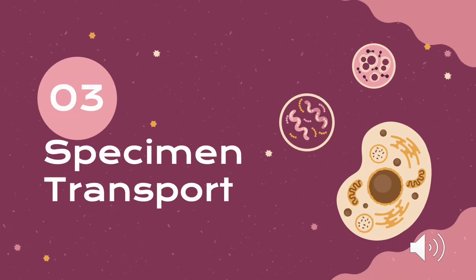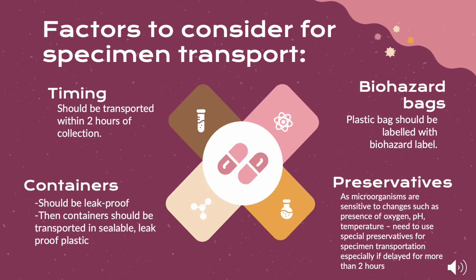In this section, the specimen transport concept will be discussed. These are the factors to consider for specimen transport. First is the timing. The specimen should be transported within 2 hours of collection. Next is the containers. Make sure the containers used are appropriate for the specimen collected, and must be leak-proof and sealed properly. The containers have to be transported in a transparent plastic bag labeled biohazard bag.